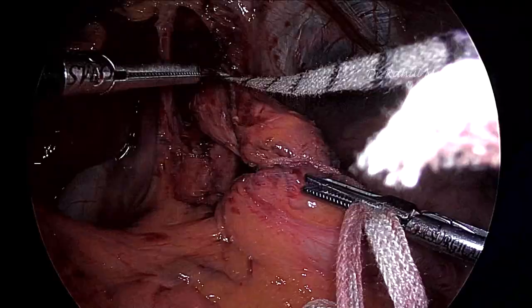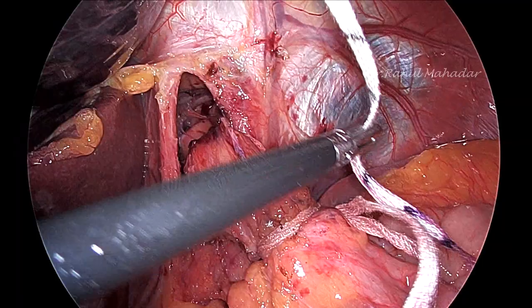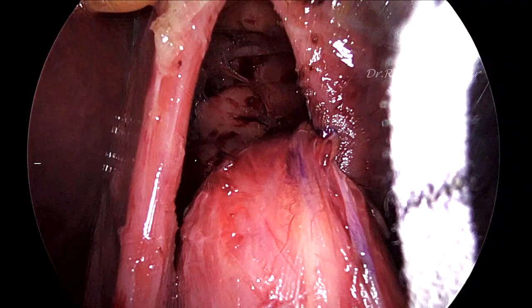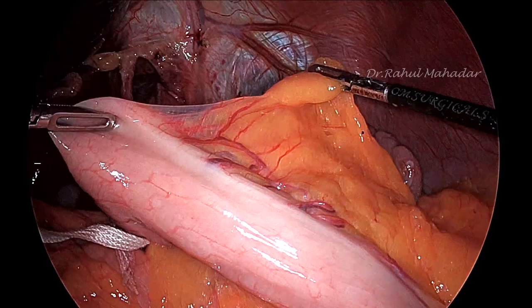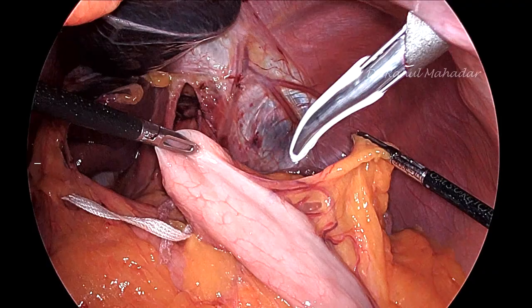Then ask the assistant to give the traction, and without traction, now you should measure the intra-abdominal esophagus length which is achieved. And this is almost 3 centimeters below the crura. So this dissection is sufficient now. Now we will take care of the short gastrics. So at the lower end of the spleen, at that level, we start dissecting the short gastrics along the greater curvature of the stomach.